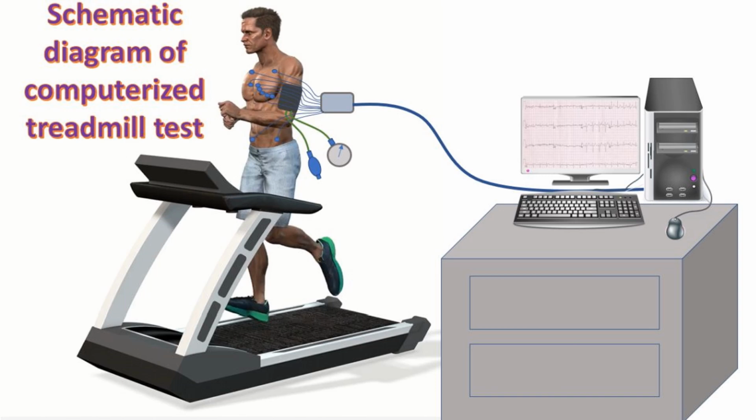After that, those who can walk on a treadmill will be connected with electrodes for monitoring ECG during the test. Treadmill slope and speed are typically increased every 3 minutes, and maximal exercise without chest pain or ECG changes is achieved. This protocol for treadmill test is known as the Bruce protocol. The test is terminated earlier in case of significant chest pain, other major symptoms, or ECG changes. The ECG printouts are analyzed by the supervising physician.